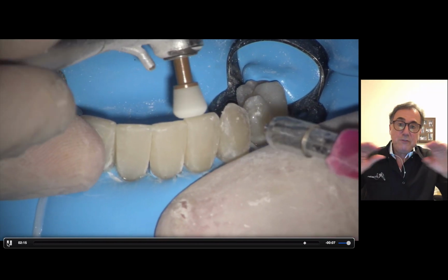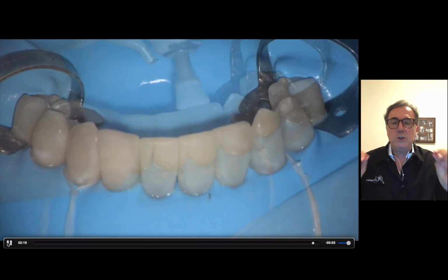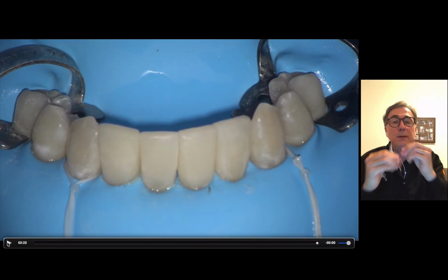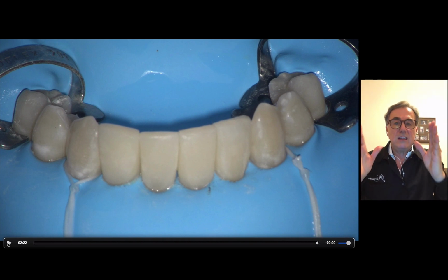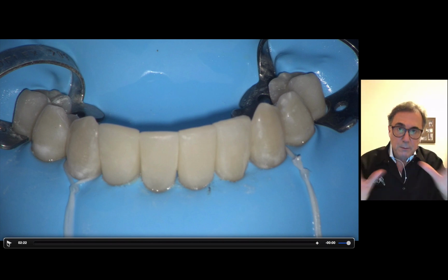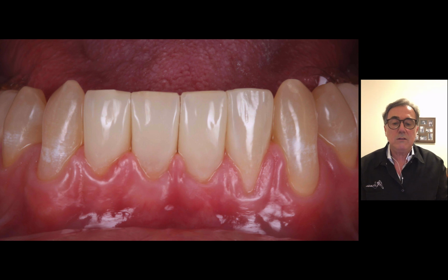So after finishing all four of them, we do some primary anatomy and a little bit of finishing, and not the polishing yet, because we want to remove the rubber dam and make sure our occlusion is correct and the proportion and everything is in the right place. So the final result is this one here. Very simple, very easy.